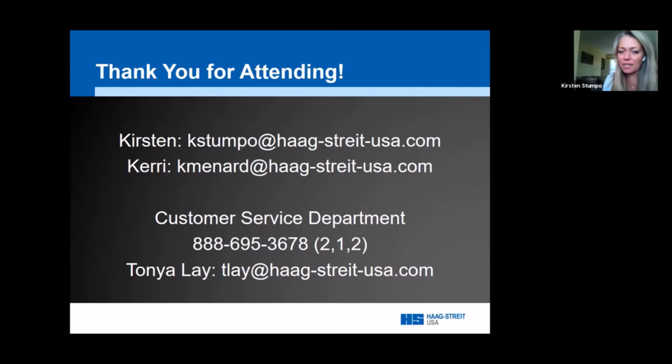Oh, the silicone oil. Oh, yeah, of course. When you are measuring and you know the patient has silicone oil in the vitreous at the time of the measurement, you do want to switch your measurement mode setting to the silicone oil. I hope that answers your question.